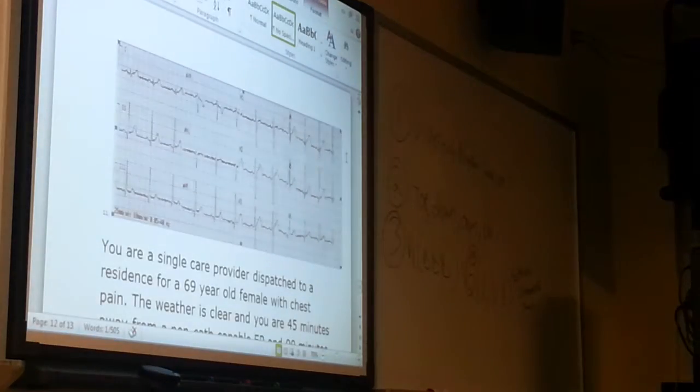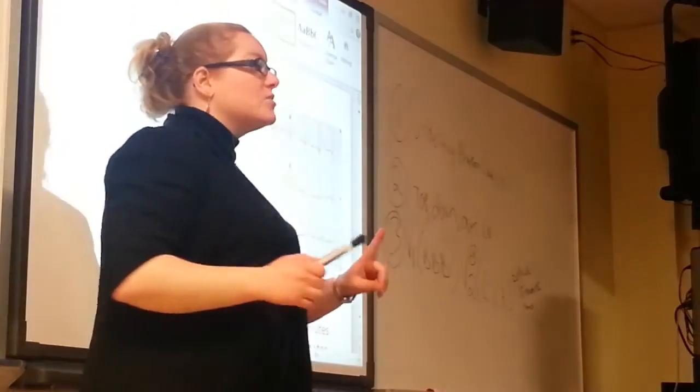So someone asked me, how do I diagnose LVH? I need someone to play in the audience. How do you diagnose LVH? I'm so glad you asked, Ian. Thank you so much. Okay, so to diagnose LVH, you're going to start counting boxes again.